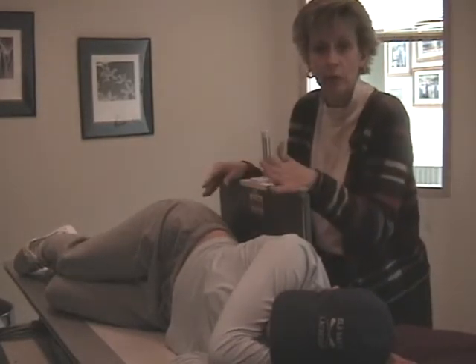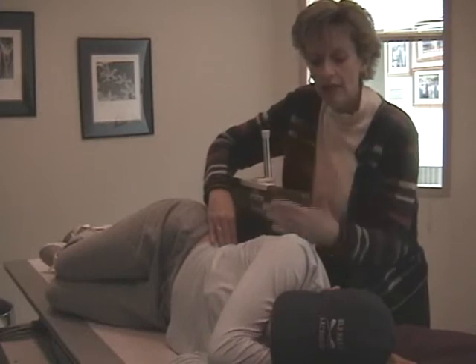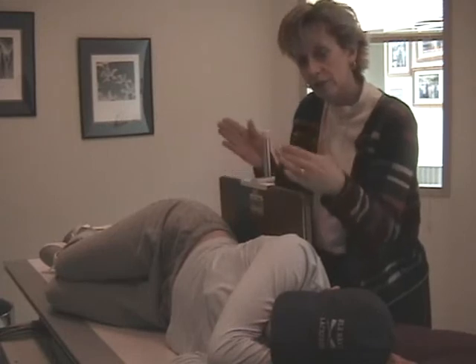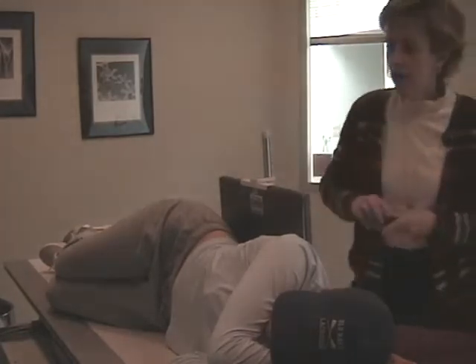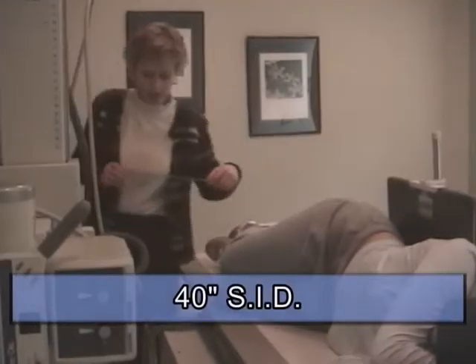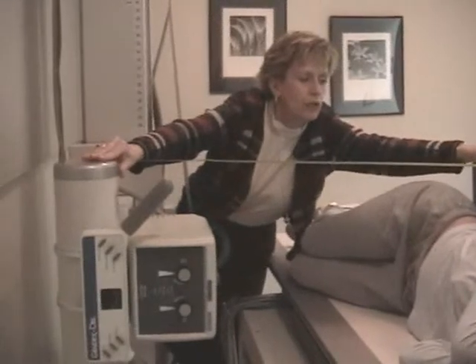But a 6'1" person, you may set it up to the center of the film to the iliac crest. But if you don't like the edge placement here, if you have not included enough lungs, you may have to shift it 1 or 2 inches higher than the crest being to the center of the film. When we do a decubitus, you still want to maintain your 40 inches of SID. Measure from about 1/3 of the way into the tube housing over to the grid wall.